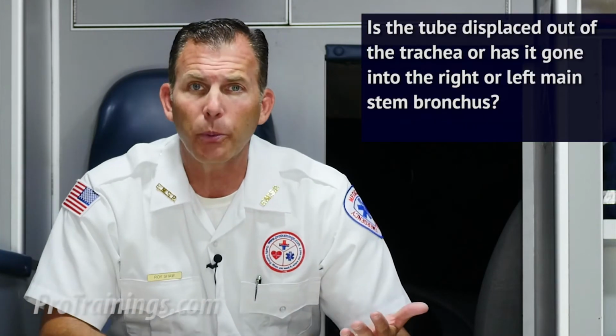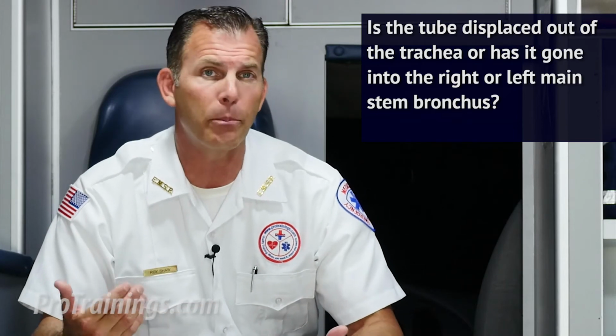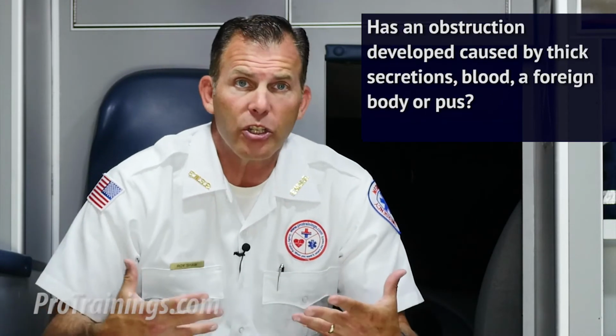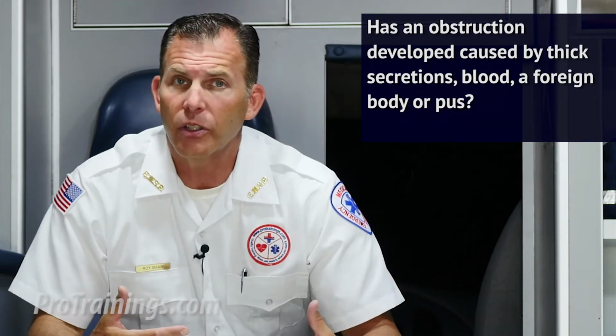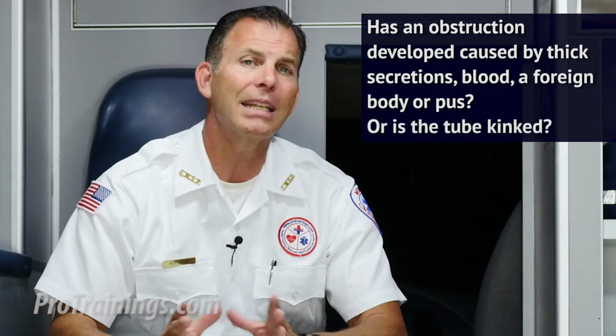In the case that an intubated patient begins to deteriorate, we should be ready to check the following in order to rule out a treatable problem. I'd ask questions like, is the tube displaced or out of the trachea, or has it gone into the right or left main stem bronchus? Has an obstruction developed caused by thick secretions, blood, or a foreign body or pus? Or is the tube being kinked?